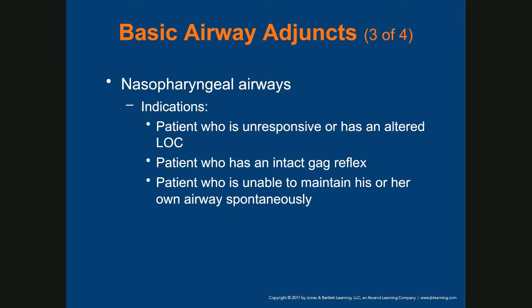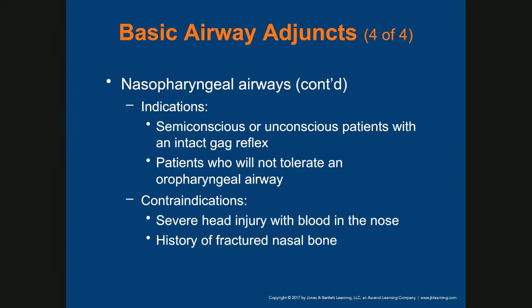So we still need to breathe for them, but we can't put anything in the mouth. So we have to put a device in the nose. That's a nasopharyngeal airway. Indication: semi-conscious or unconscious patients with an intact gag reflex, or a patient who will not tolerate an oropharyngeal airway. Contraindications: if the patient has a head injury with a suspected skull fracture, we do not use the NPA, or nasopharyngeal airway.